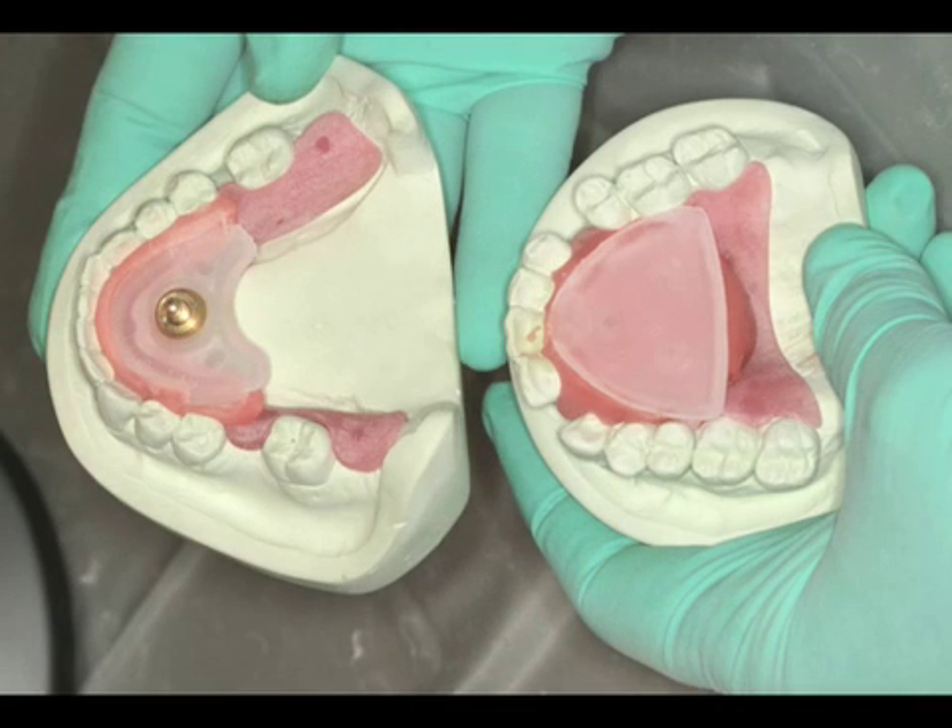As seen here, we have the completed mounting of the maxillary and mandibular jaw recording devices onto the base plates of the dentate patient.